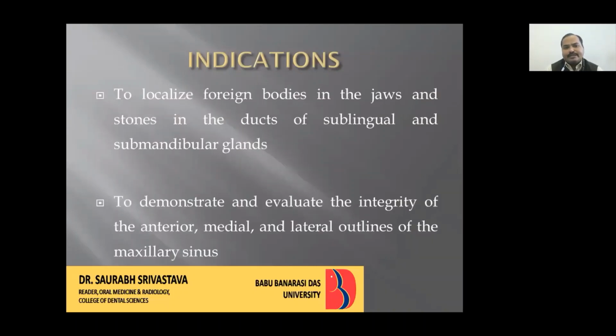Then the other indications are to localize foreign bodies in the jaw. If due to any trauma a foreign body is embedded, or any other foreign body is embedded accidentally or iatrogenically, it can be localized using this radiograph along with other techniques. Any sialolith, be it sublingual or submandibular, can also be localized.